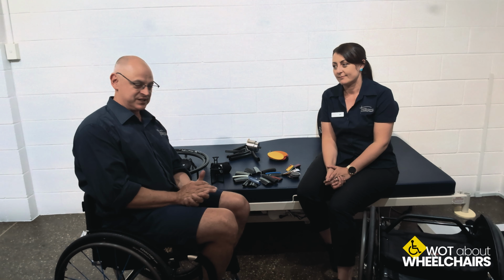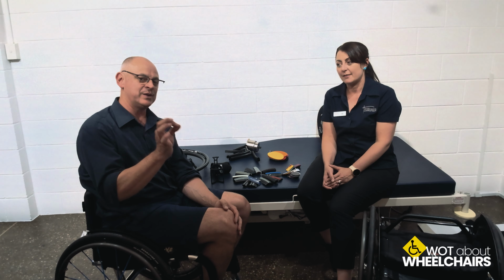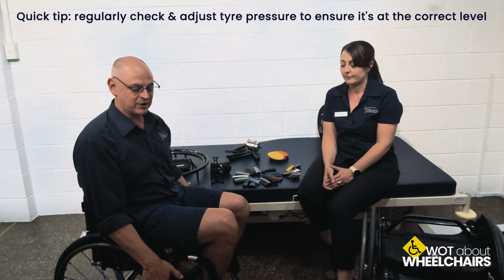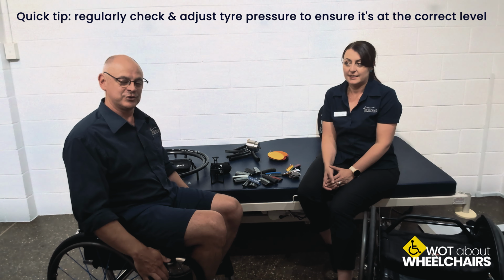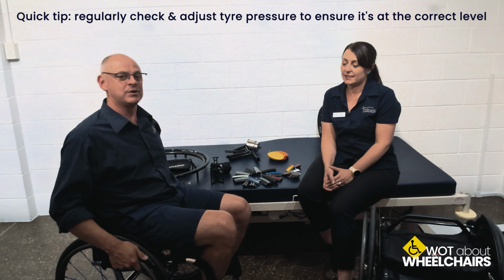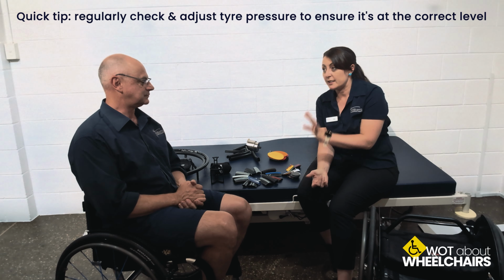Before we sign off on manual wheelchairs, because I think this is the last thing in regards to manual wheelchairs themselves, I just want to give a maintenance tip, because even in the driving side of things, we see this all the time. Today we've spoken about tyres. You've got to have the right pressure in your tyre. So many times I see people come into their assessment for driving, and we're trying to do a transfer into the driver's seat, and the wheels and the brakes don't work with each other. The tyre pressure's gone down, the grip on the tyres has worn off, and they literally can't propel this wheelchair. I can if I use all of my strength when the brakes are on. But some of the clients that we see, it's not even worth having brakes. They're just ill fit. And that's a really important point in terms of maintenance.